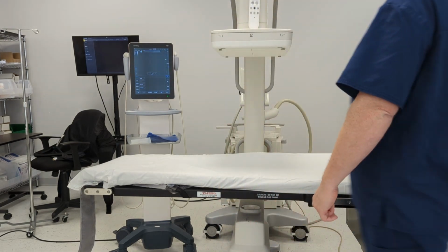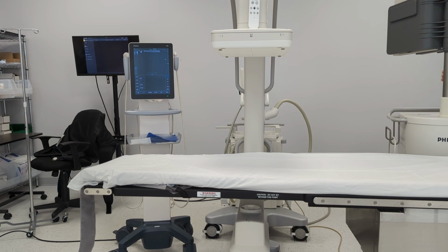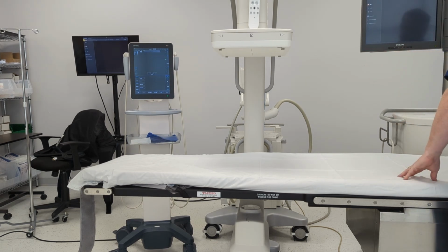Now we will bring the screens in just a moment, and we will work over the legs and feet of the patient, and I will work off the end of the table. We will raise the bed to improve image quality.